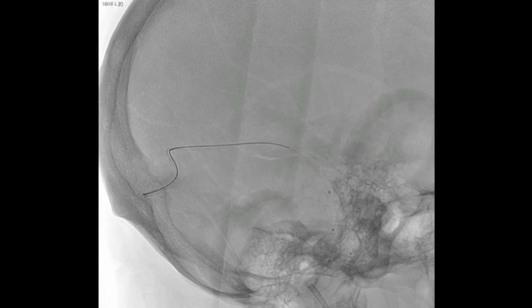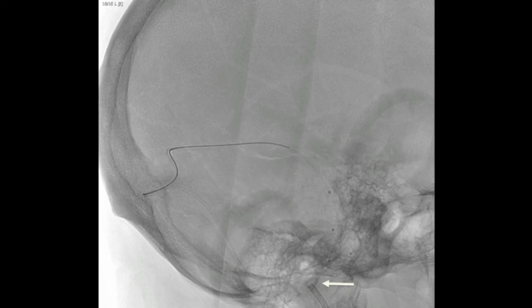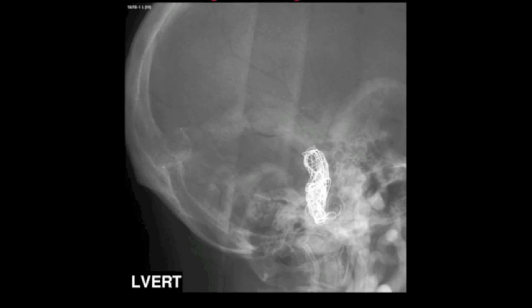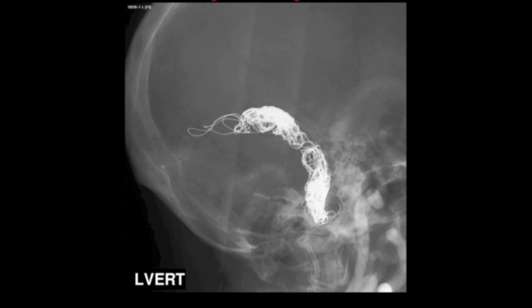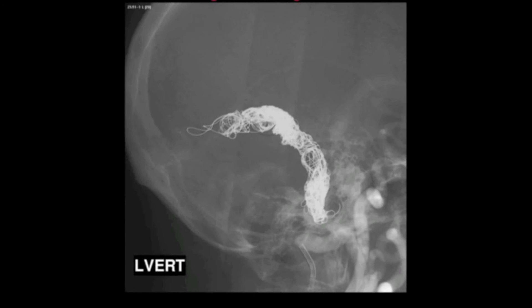Transvenous access was obtained and the patient was fully heparinized. A guide catheter was navigated into the right internal jugular vein. Two microcatheters were placed into the fistula's left transverse sigmoid sinus. As coil embolization proceeds, one microcatheter is pushed back and out of the transverse sinus.